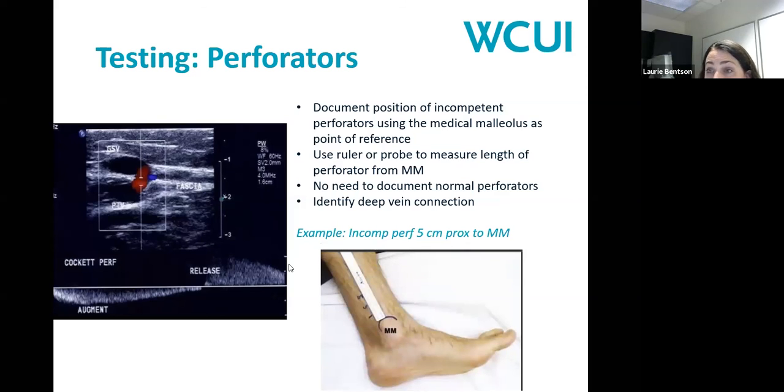And we would evaluate, we typically start at the medial malleolus, using the posterior tibial vein as a landmark, and then start following and flashing as you're scanning, ascending the calf, searching for incompetent perforators, and looking at the superficial system and the deep system, and what's connecting, and what's enlarged, what appears normal.